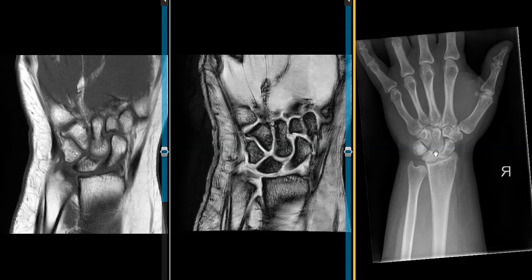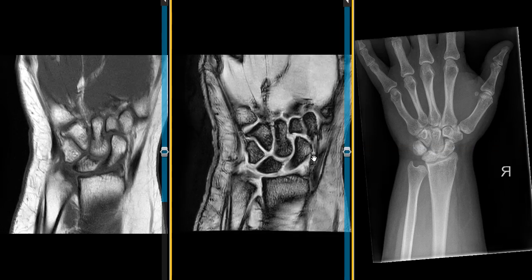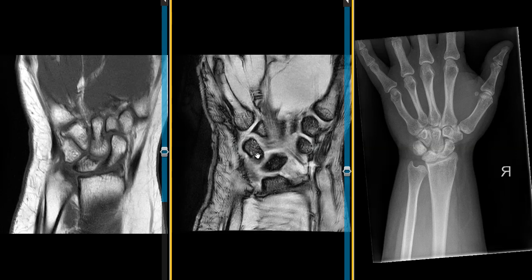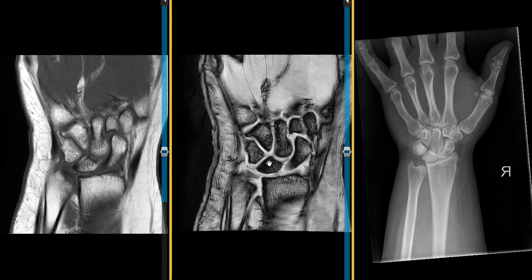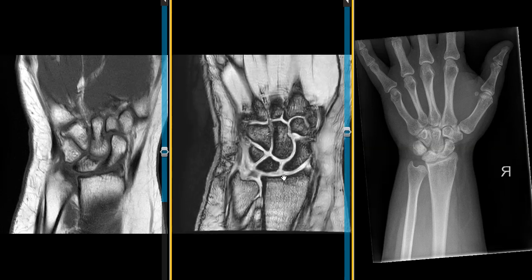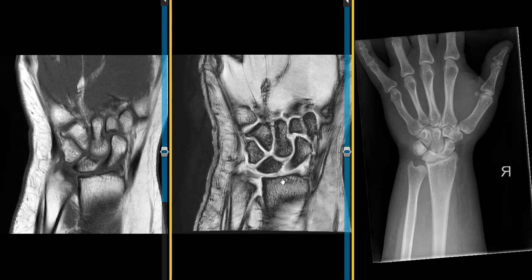We're going to look at that lunate bone now. On this view we see the carpal bones — this is the scaphoid bone, lunate bone, and this is the triquetral bone. You can see that this bone looks a little bit different. These are called gradient echo images; they give some unusual signal and we don't really look at the bones much in these, but we can see that this bone does look a little bit different than the other bones.